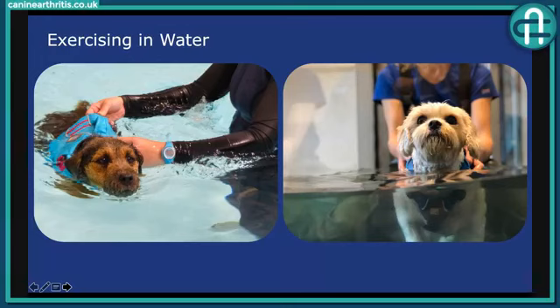So open kinetic chain exercise means you don't have that proprioceptive endpoint, as I mentioned. It can be useful when there's loss of range of motion or swelling, which your pet might otherwise find difficult when they're undertaking underwater treadmill therapy. So it can be a very useful form of exercise, but we're not going to be talking about swimming in depth today.